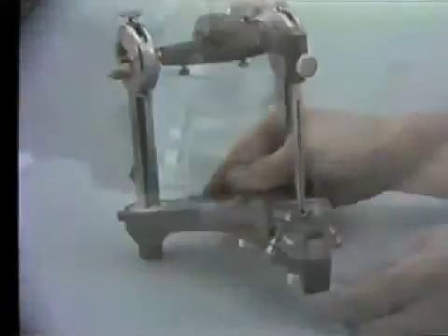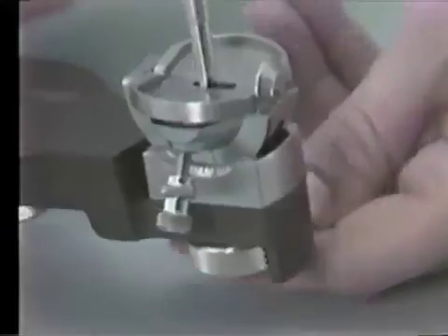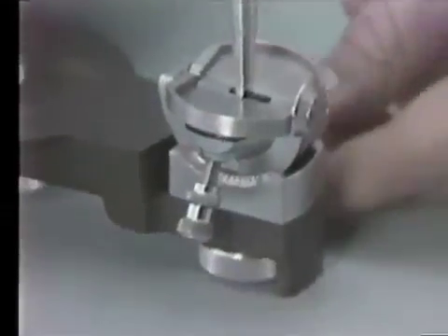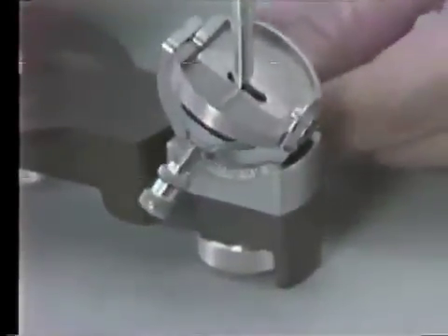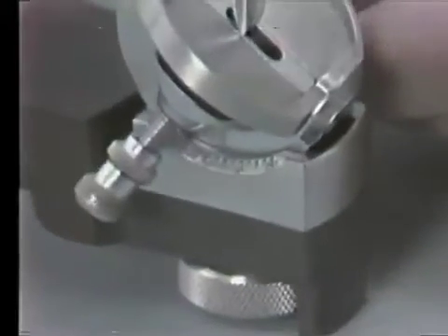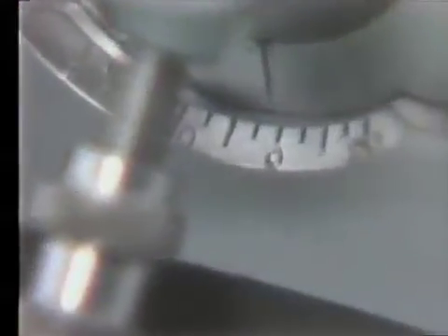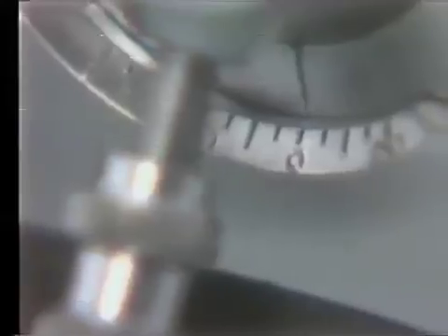Next, unlock the lock nut at the base of the incisal table. Rotate the table to see if it moves freely, set its scribed line at zero, then tighten the lock nut.